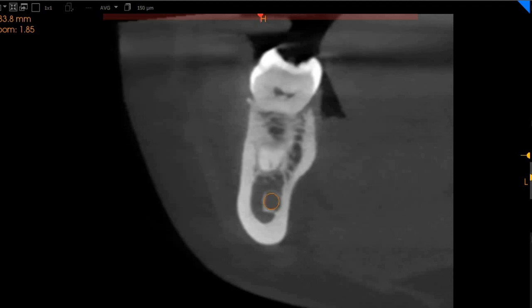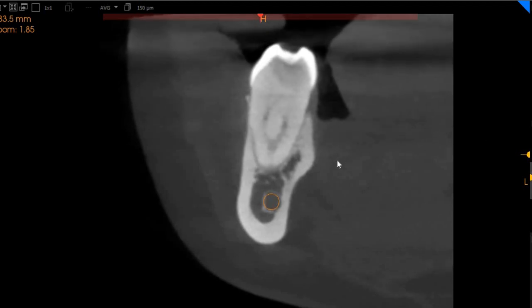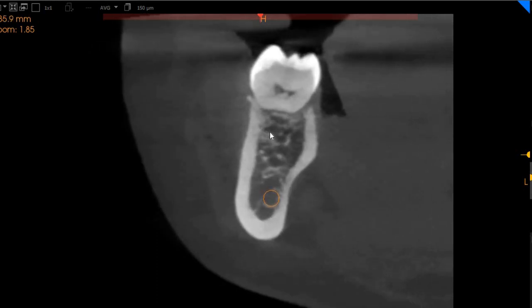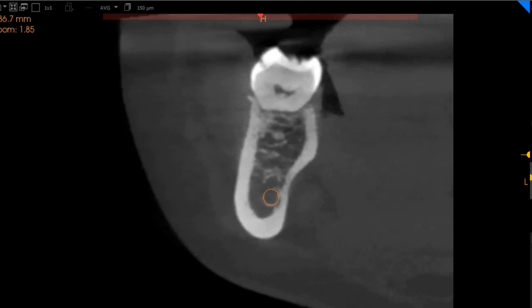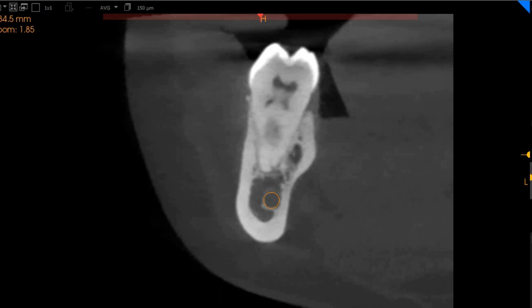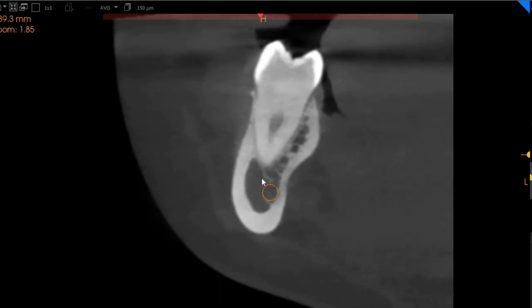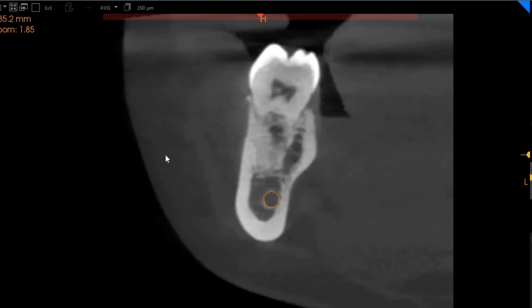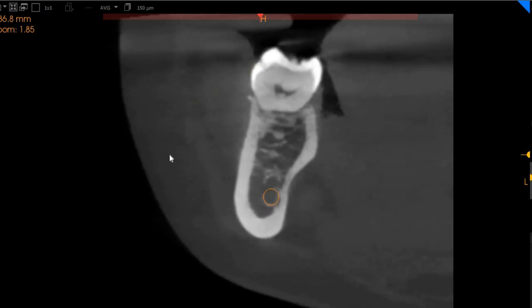This is the transaxial view of the lower left 6. We don't see any major carious lesions. We do see a slight fracture right here, so this could be the cause of the initial concern. The fracture does not go very deep. We don't see any radiolucencies or any J-shaped radiolucencies. The only pathology associated with this tooth is right here, so it could be a traumatic event.